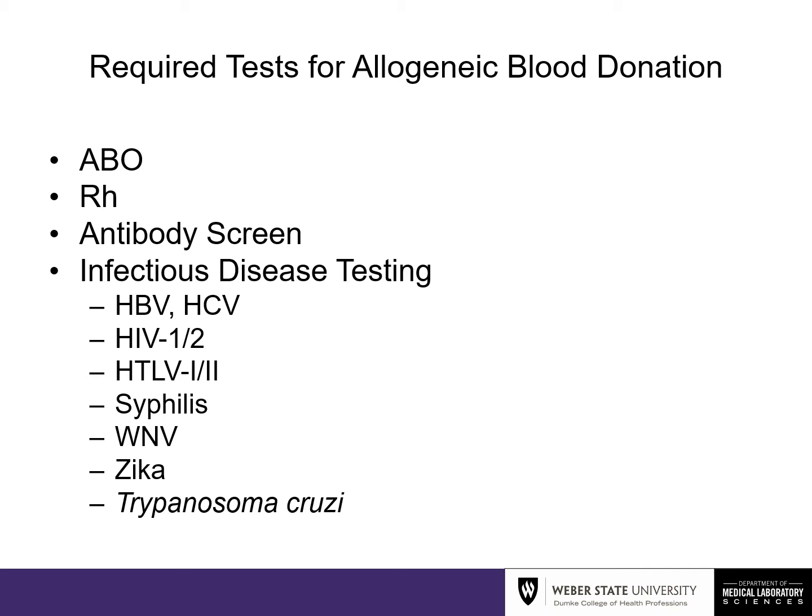HTLV 1-2, syphilis, West Nile virus, Zika virus, and T. cruzi. T. cruzi is also known as Chagas disease, so you can call it either, whichever one you prefer.